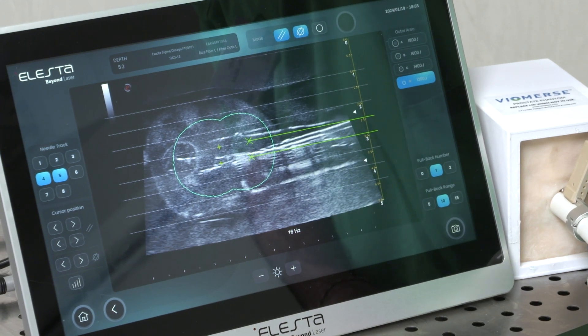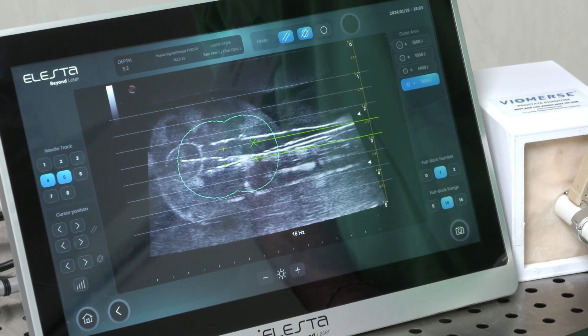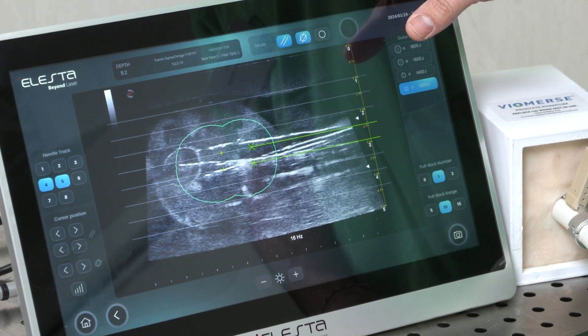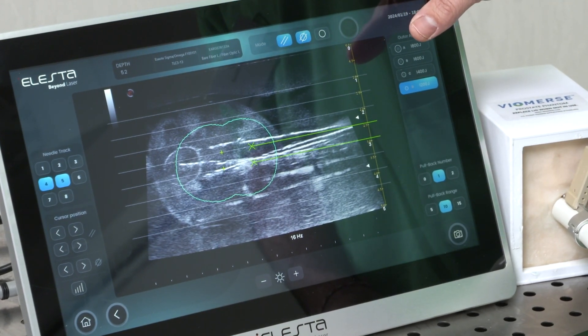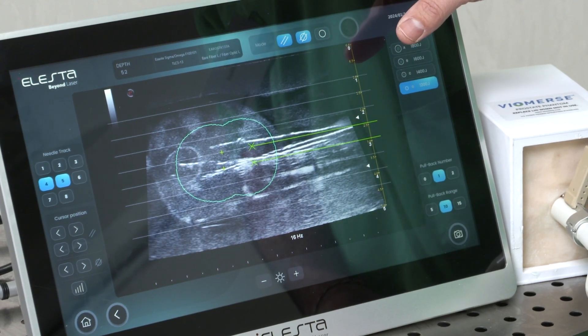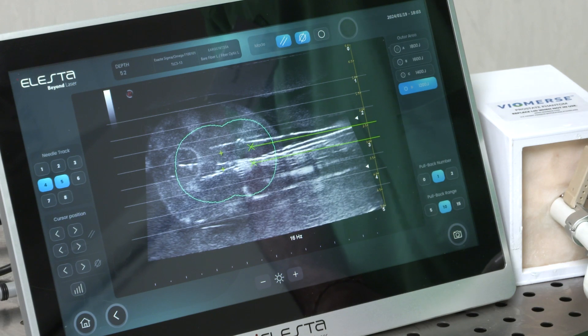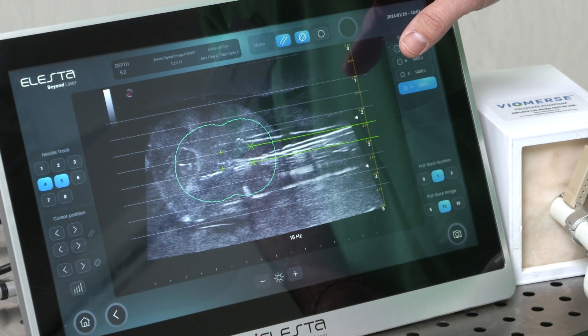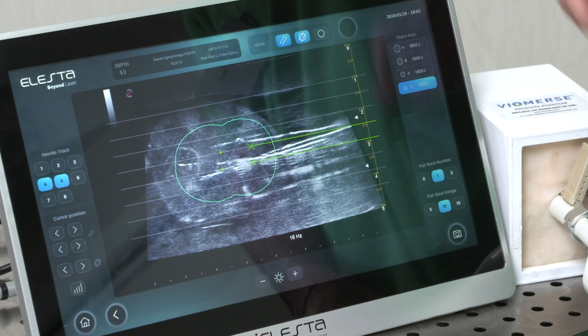It's very important in this step to check that all critical structures — like the prostatic capsule, bladder neck, and urethra — are far from the tip of the laser fiber in order to avoid adverse effects.